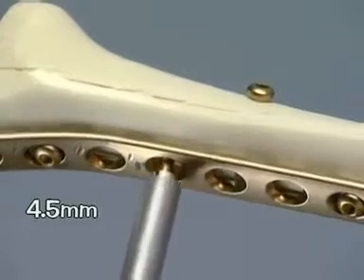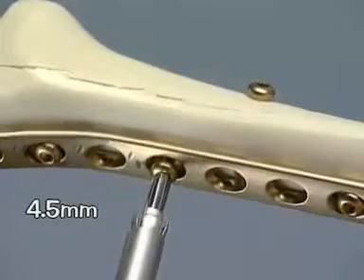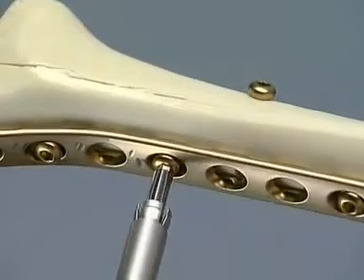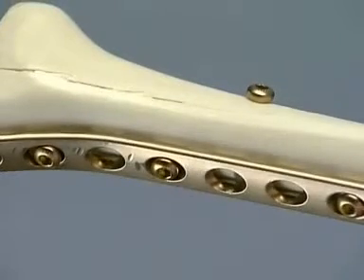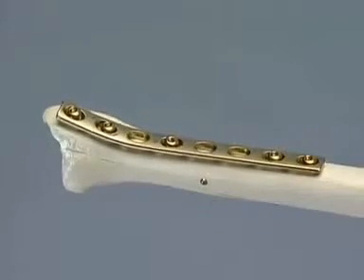The shaft screw offers a better gliding ability in the gliding hole, resulting in optimal interfragmentary compression. The fixation is stable. No more screws are necessary.